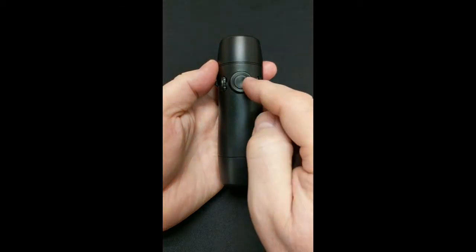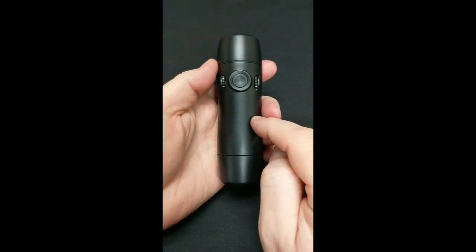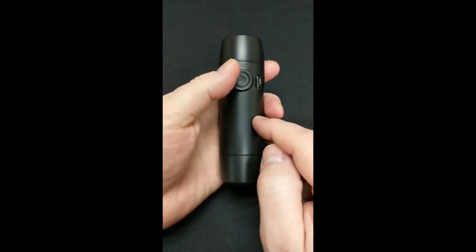They're very simple — you just rotate them up to go higher and rotate them down to go lower. You don't have to have the device on for these changes to take effect, but I'm going to turn the device on so that you can hear them.